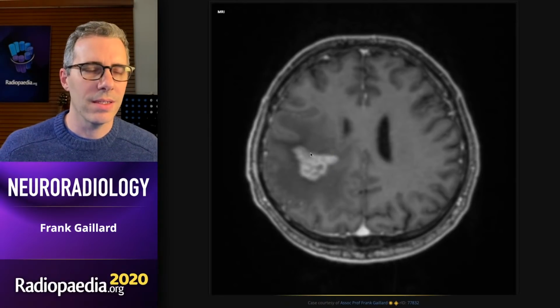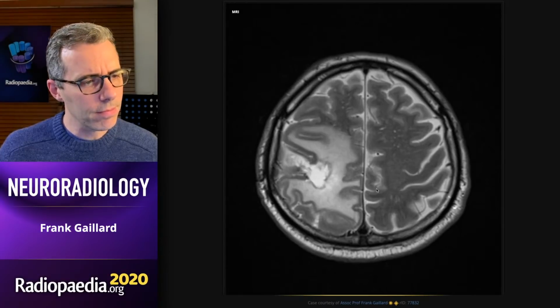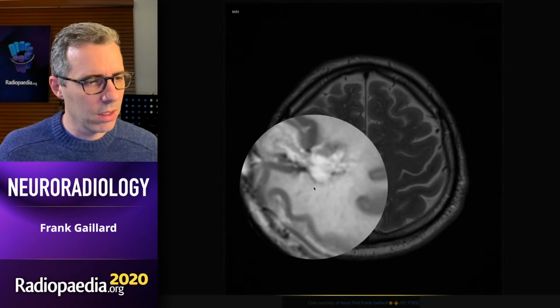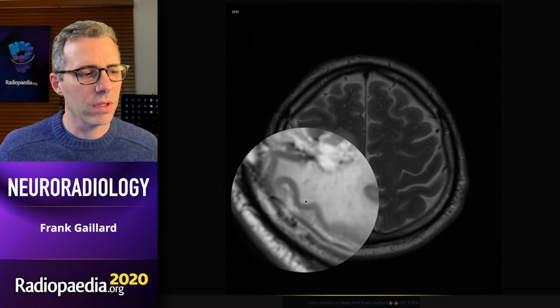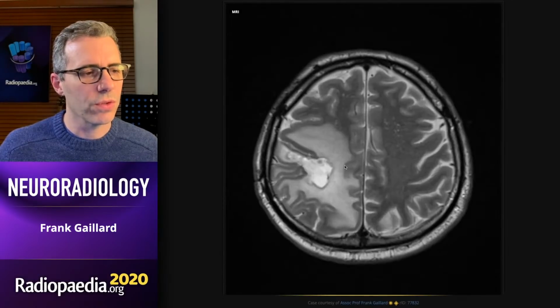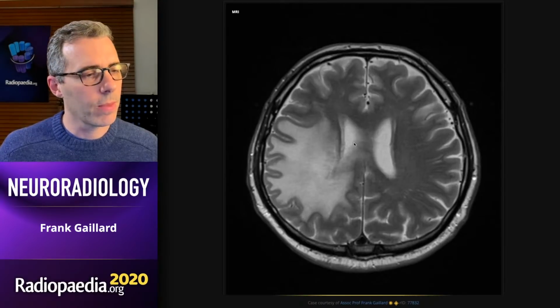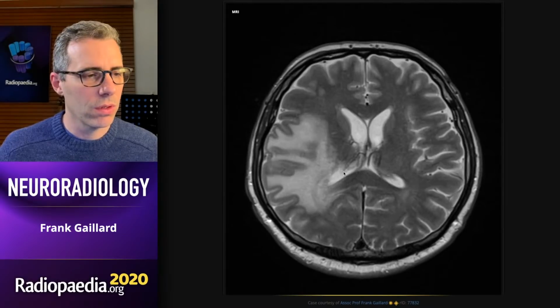That's concerning down here. So if we have a look at T2, again, see that beautiful vasogenic pattern. Lots of high T2 signal washing up against the borders of the cortex, and we're seeing really high signals throughout this. Here we're fading into normal brain. As we come inferiorly, note again here, it looks a bit darker than before.